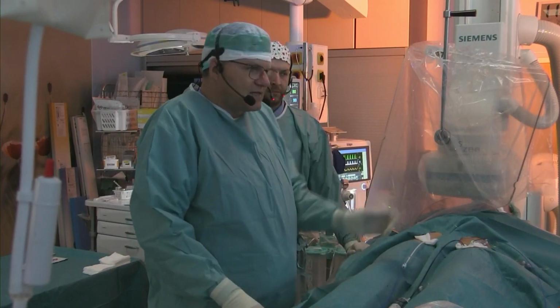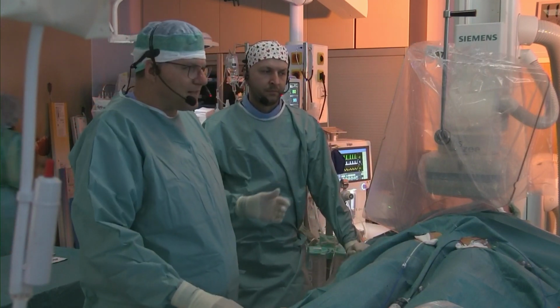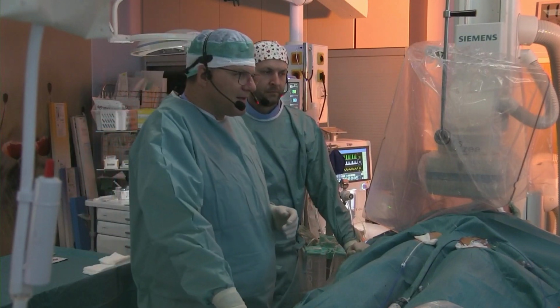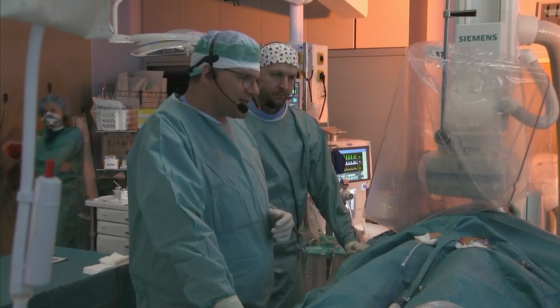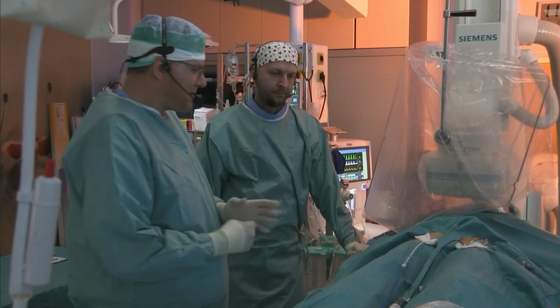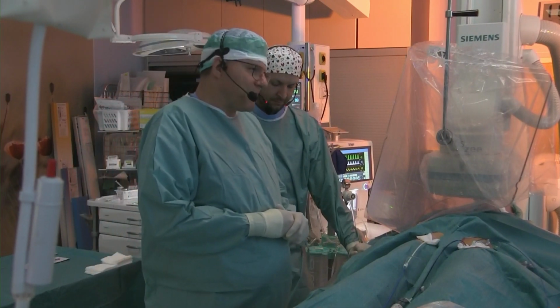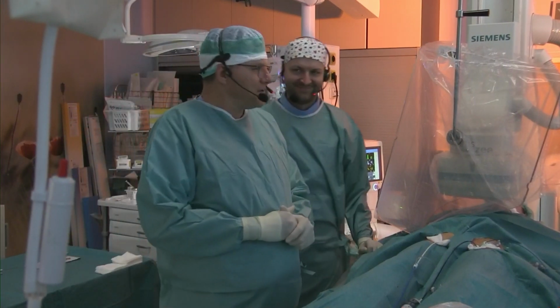This is not far, and the pulse field energy may reach rather deep and be effective even when not in contact. But let's report this next year if there is recovery. Hopefully there will be, because this would probably be the first permanent phrenic lesion in the world.